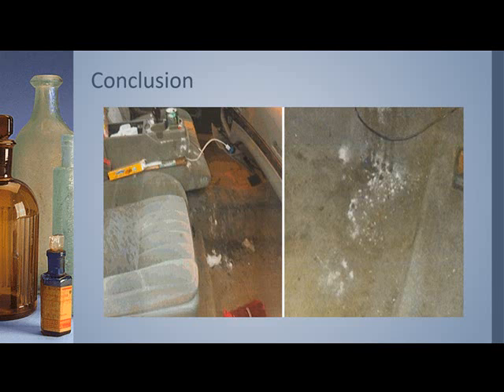To answer these questions, the evidence gathered by the forensic toxicologist is examined in context with all other available evidence at the scene, such as fingerprints, footprints, hairs and/or fibers, and any other trace evidence to help determine the most likely cause, and in some cases, the most likely suspect. Let us now begin our lab investigation.